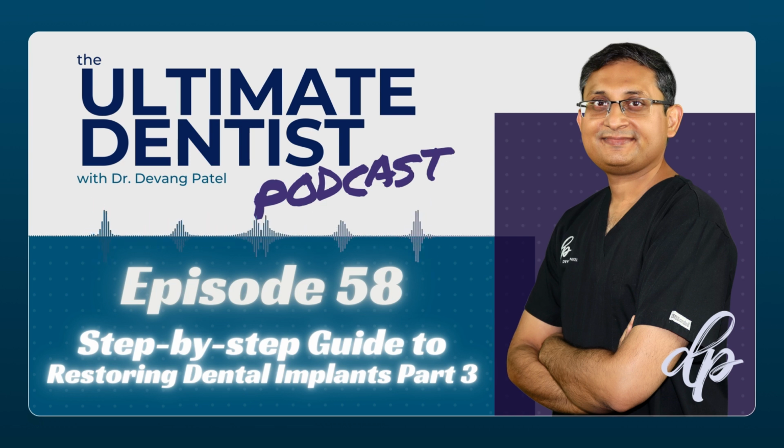So you know what you do with the cement retained crown; the technician does the same thing outside the patient's mouth, in the lab, and just creates the hole so you can access the abutment screw. Now this works really well if your implant is in the right position. Let's imagine that you're restoring upper right one, and the implant screw access hole is coming out from the buccal aspect.